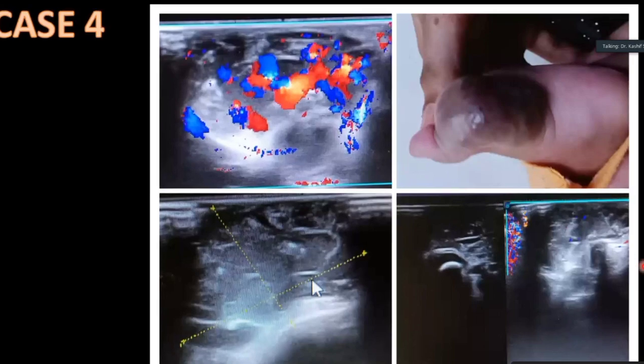We can see here a large swelling at the ventral aspect of the right foot, and on ultrasound there are multiple internal cystic areas showing blood flow in and out, and there are a few phleboliths sitting within this lesion. So this is a typical imaging appearance of a slow-flow vascular malformation with the first differential diagnosis of venous malformation.